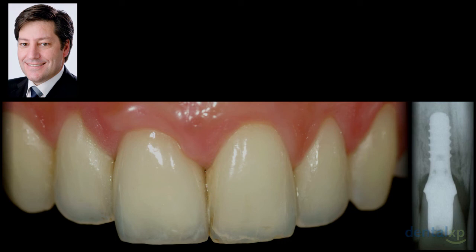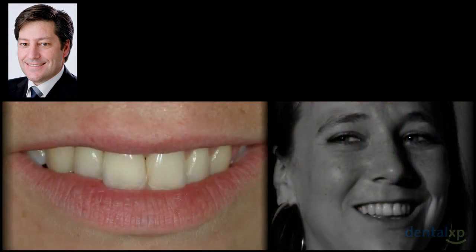I always say the same. I wasn't really happy with this bump here, but the patient says, you know what, you don't touch my tooth anymore. I'm happy like that. And I didn't have an extra chance. But no, it's well integrated. You see here translucency and mimicking all these aspects for this patient. You can see here, this is the patient at the follow-up.